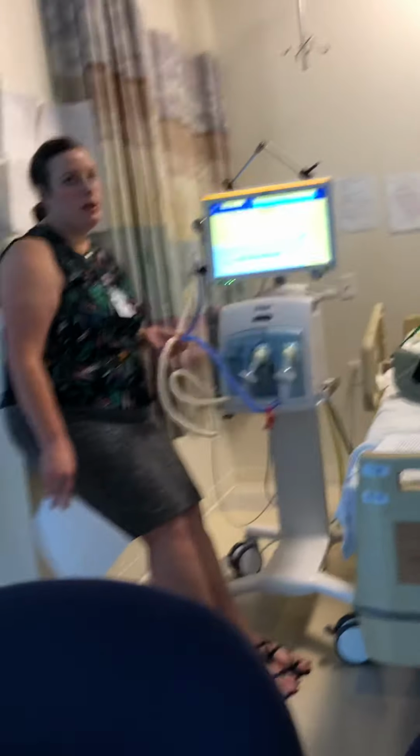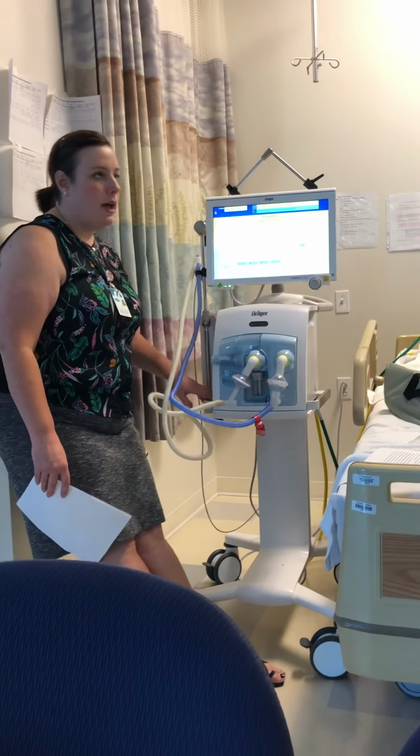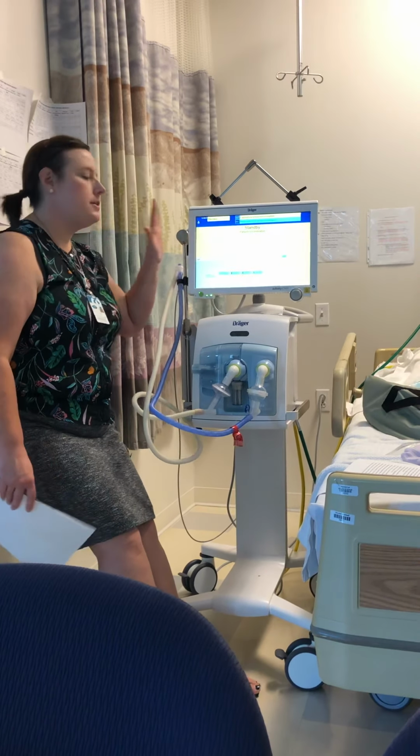You need the high pressure hoses, you need the circuitry. This is a neonate circuit. This is the size of the neonate circuit. As you can see, it's smaller than the adult and or the pediatric circuitry. Currently, I don't have a heater on here because we didn't have a spare heater. I should have taken it off that one, but I was trying not to.